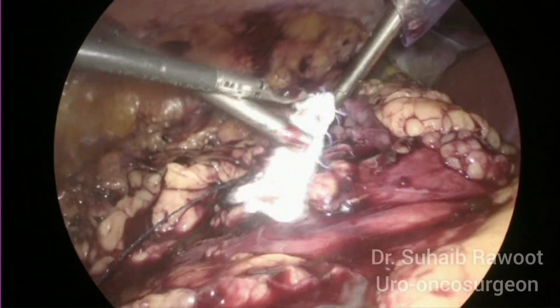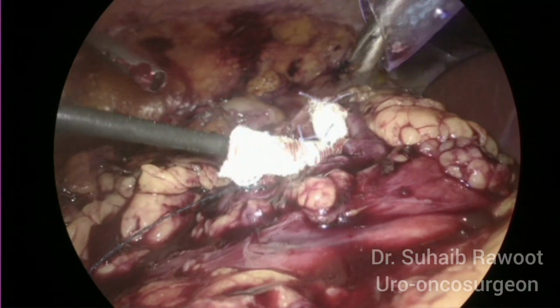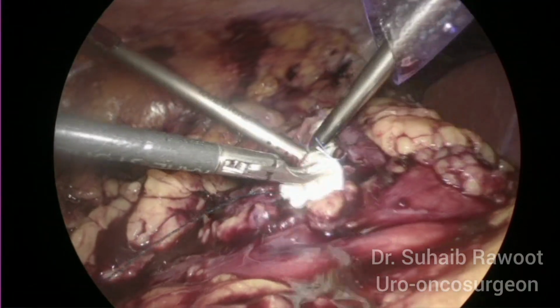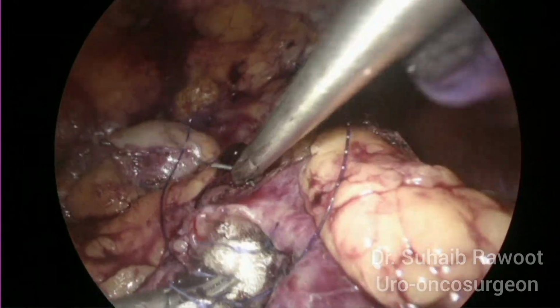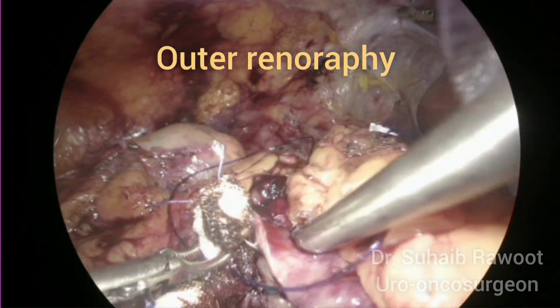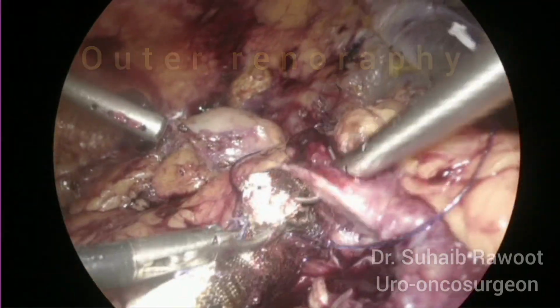Inner renorrhaphy is completed. Now we have made a surgical bolster using Surgisil. We are placing it in the tumor bed before doing the outer renorrhaphy. Use of a bolster is a personal choice. You may or may not use it according to your personal preference.